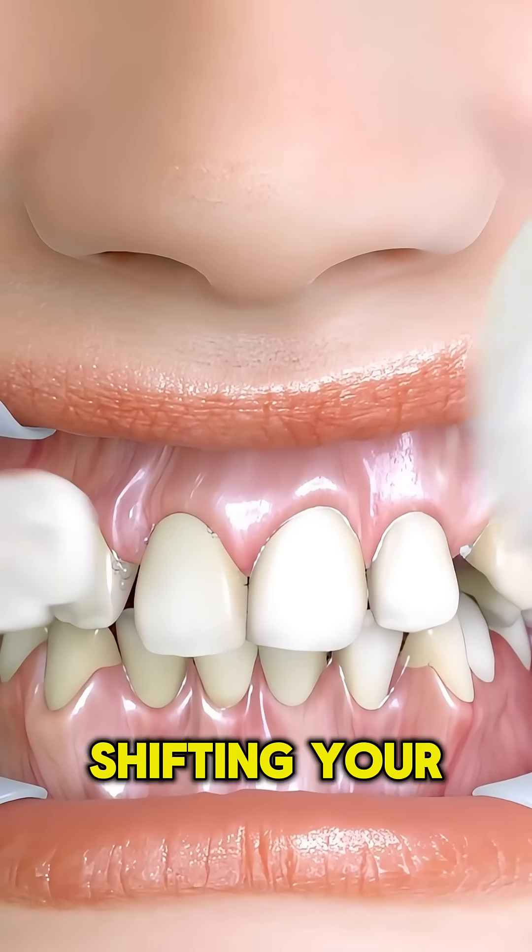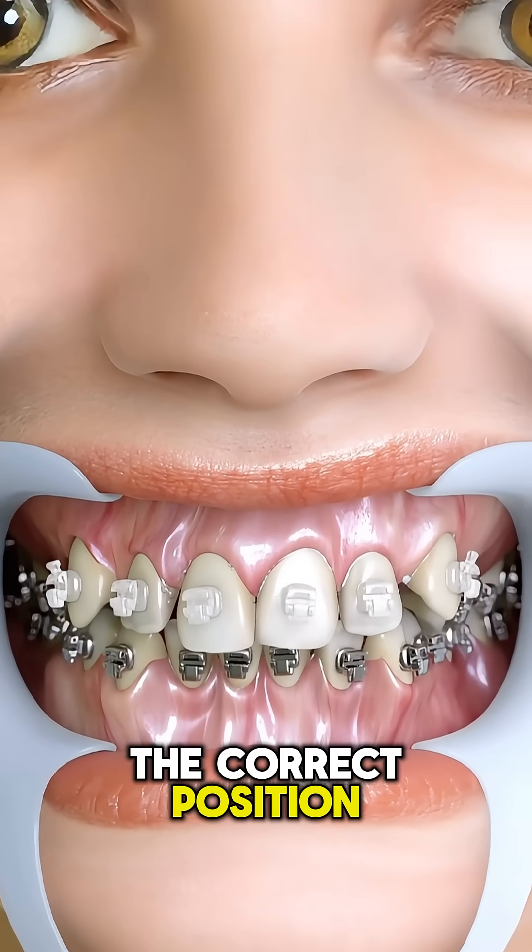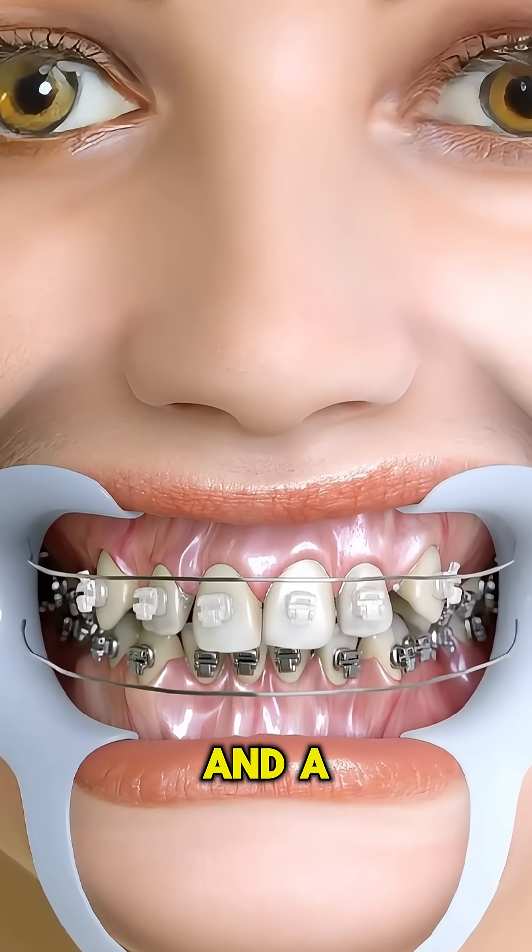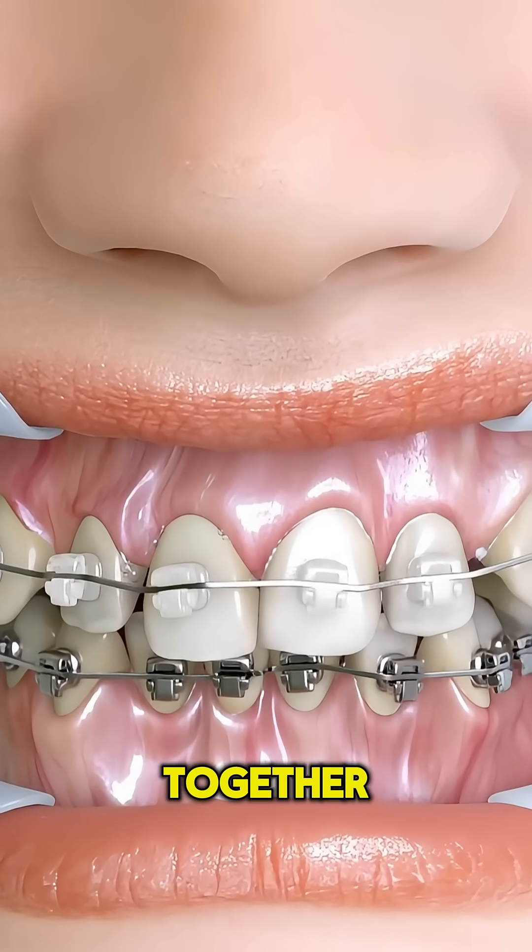Dental braces work by slowly shifting your teeth into the correct position using gentle, constant pressure. Each bracket is glued to the surface of a tooth, and a metal arch wire connects them all together like a track.